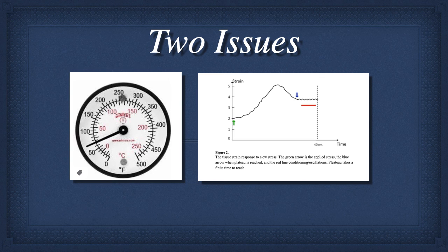And so here's where the problem comes in with a lot of the previous elastography studies, including ours, using ultrasound. You have to apply a pressure that's near the elastic modulus of the tissue. It's just like you need a thermometer that's roughly around 98.6, where there's a lot of gradations in that area.